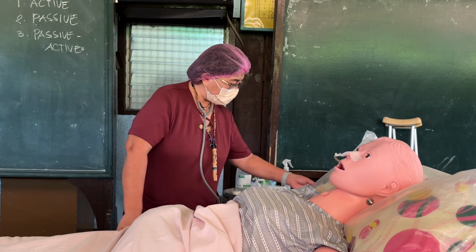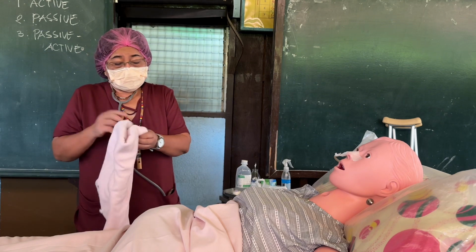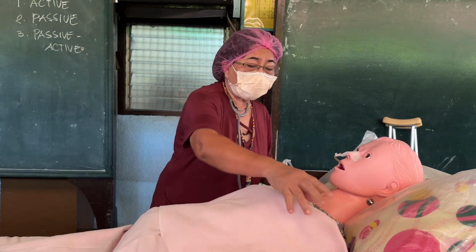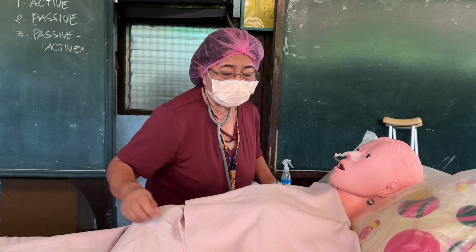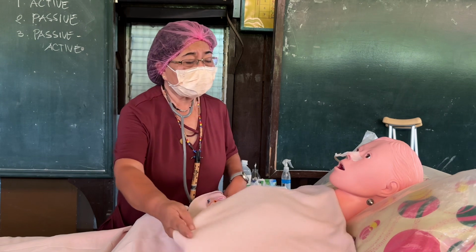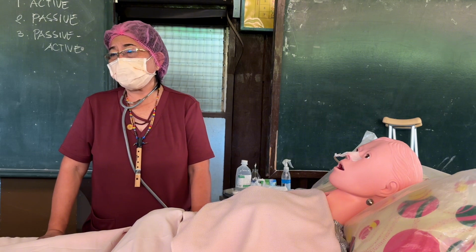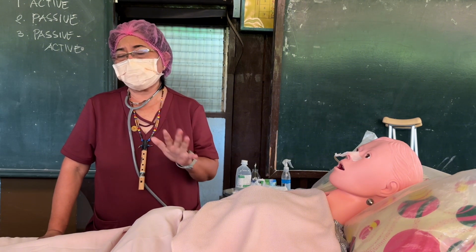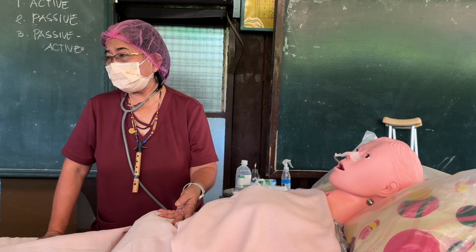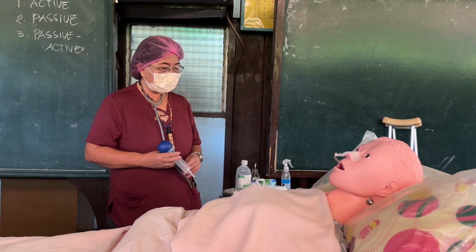So again, we put a towel. Class, don't forget, every time you introduce anything in the tube going to the stomach, you have to do the 5 ways to check for confirmation that the tube is still in the stomach. It's very dangerous, class. If the patient moved around and you did not check, it may have gone to the lungs. So, confirmation, 5 ways to check, should be done before introducing anything in the tube going to the stomach. Okay? Confirm that the tube is really in the stomach.